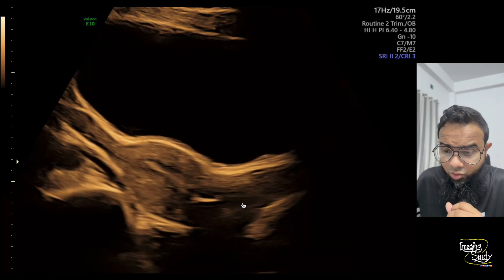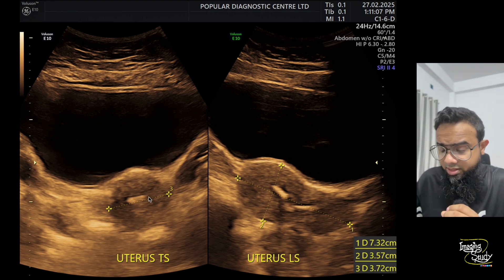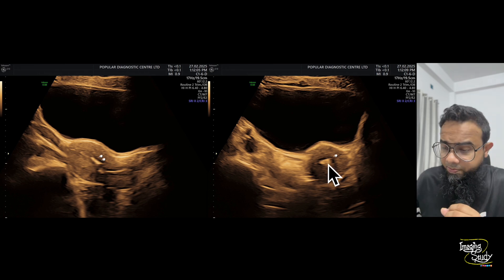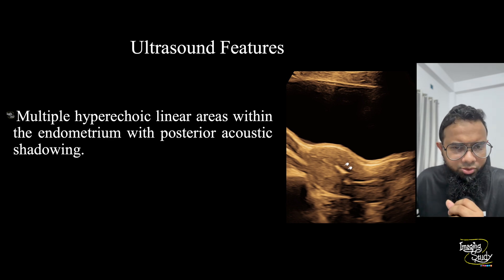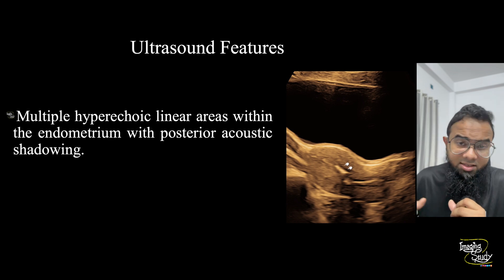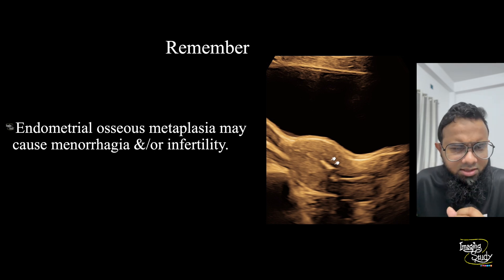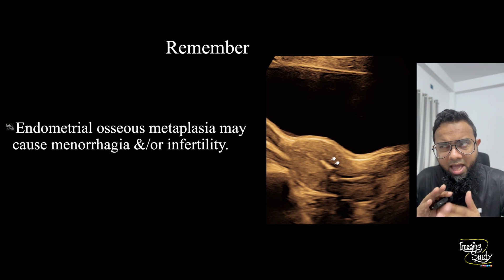The uterus is normal in size on both longitudinal and transverse sections. These are the calcific foci visible on both sections. In summary, there are multiple hyperechoic linear areas within the endometrium casting faint posterior acoustic shadows. These features are consistent with endometrial osseous metaplasia.